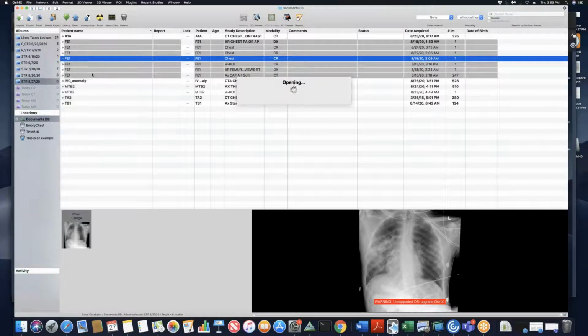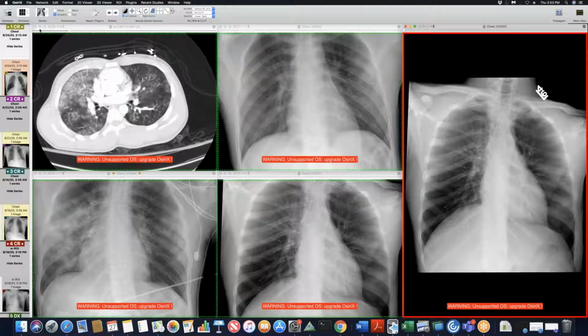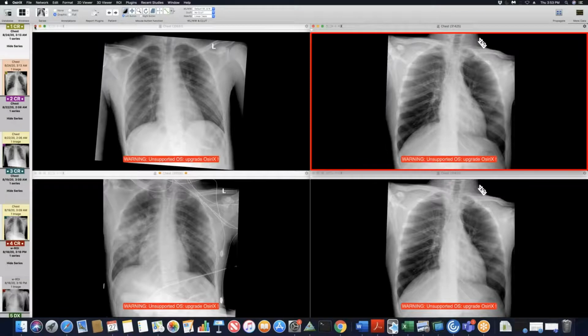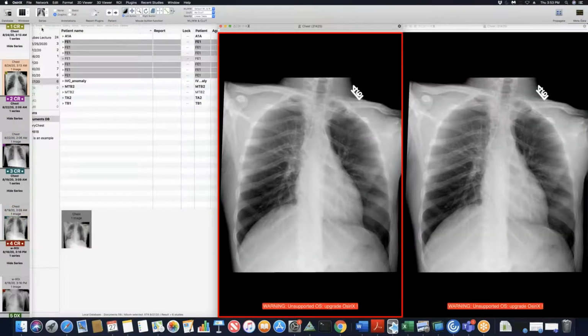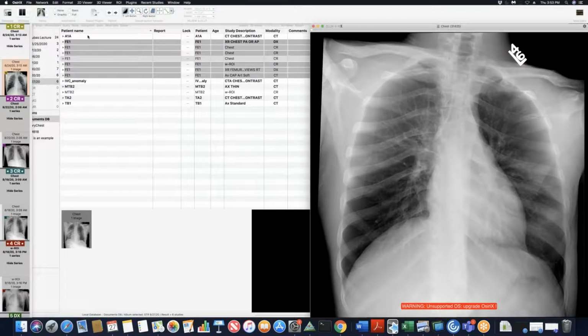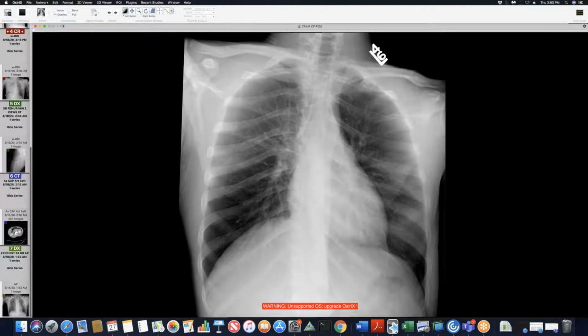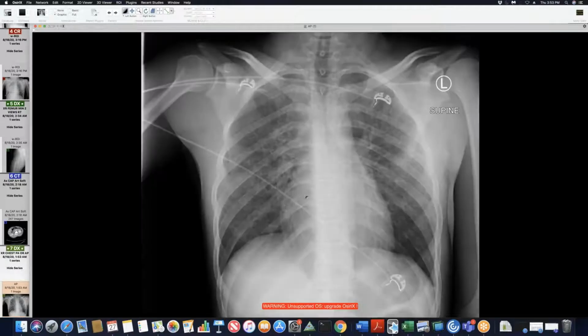This is one that's been shown before, but I think it's just a diagnosis that gets overlooked, and so I wanted to show it. It's kind of impressive. So he is a 19-year-old patient, and he's coming in for a MVC. So he's getting a trauma workup.